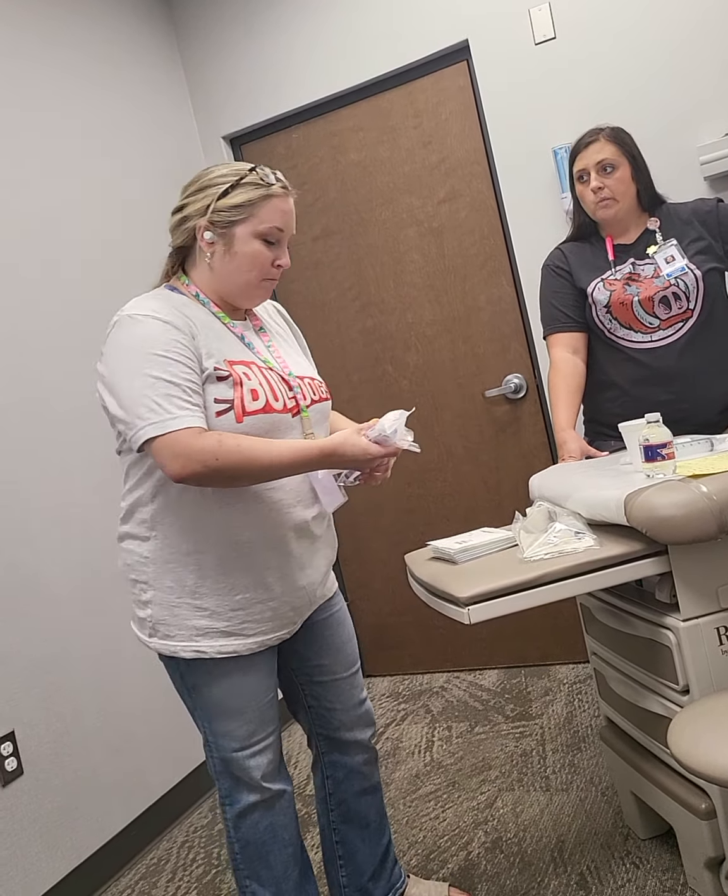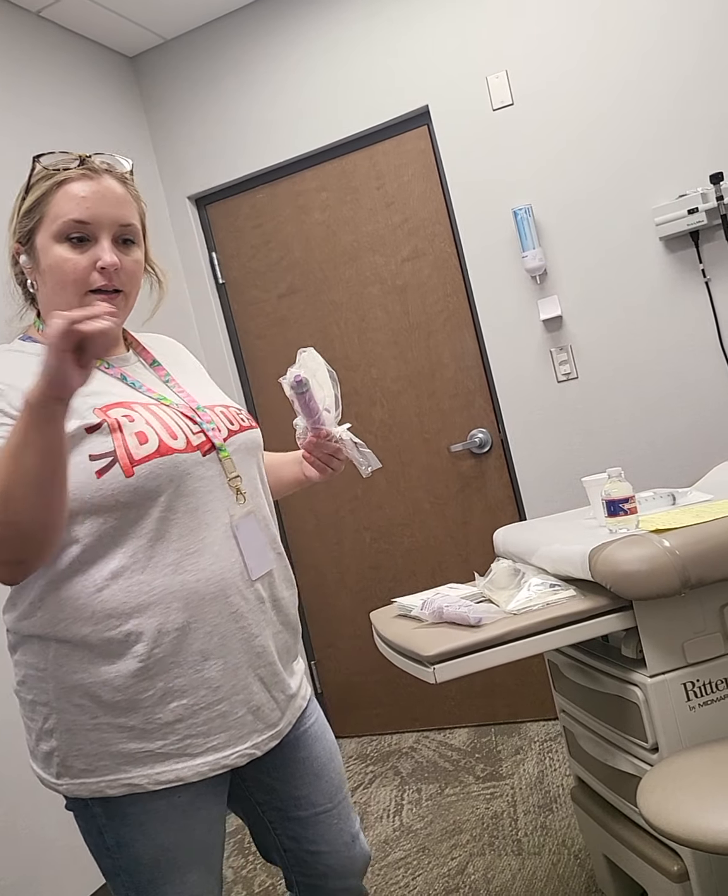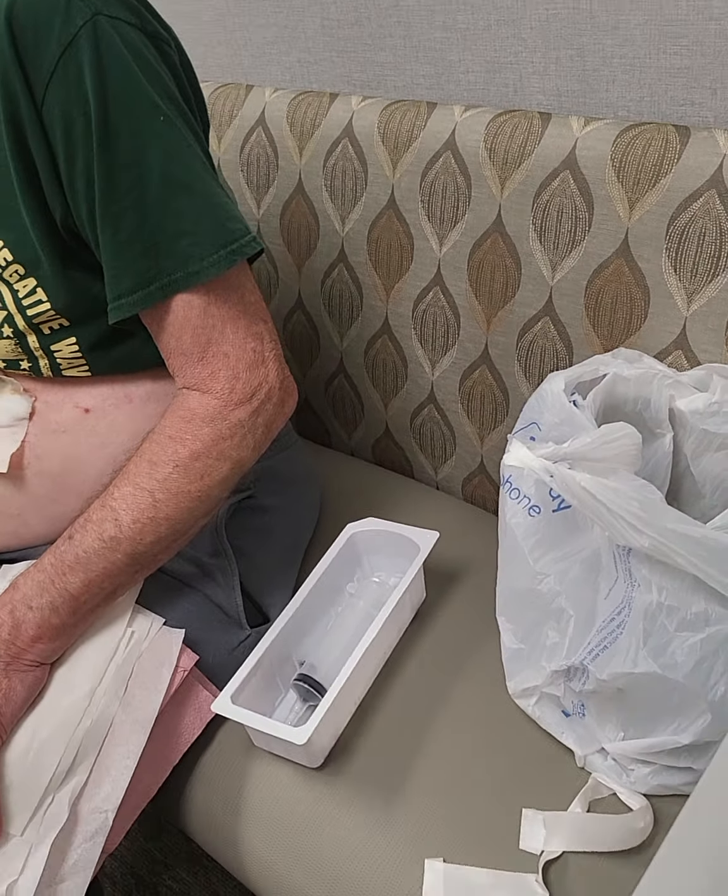These are the two syringes I'm sending home with you. They're called Enfit — E-N-F-I-T. It's in this book and I'll point it out in a second. That's just the type of connection that you have.